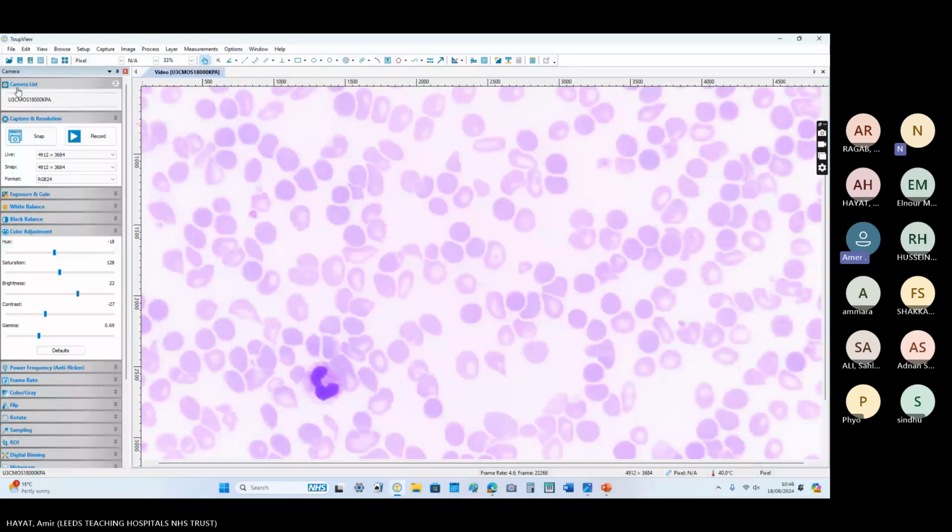Okay. But I'm not sure, because if this patient has recently been transfused, then HPLC would not be of much help. So this patient has been transfused in the ED because her hemoglobin was 52 and she was symptomatic, tired, and short of breath on exertion as well. So she has been transfused. All right. So you would like to do HPLC. The FBC is in front of you.